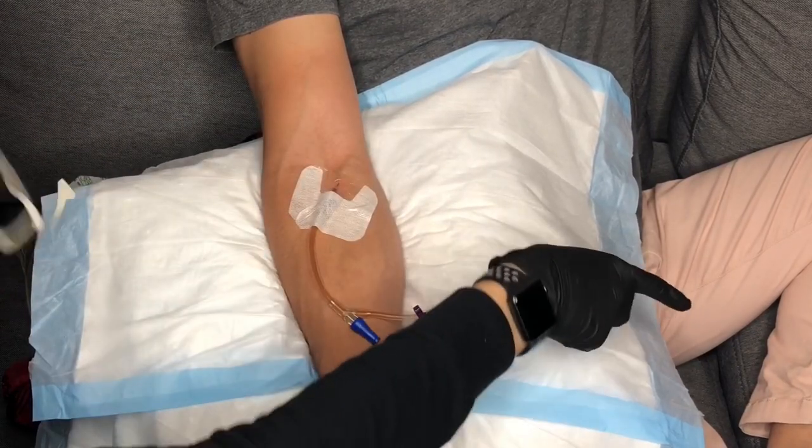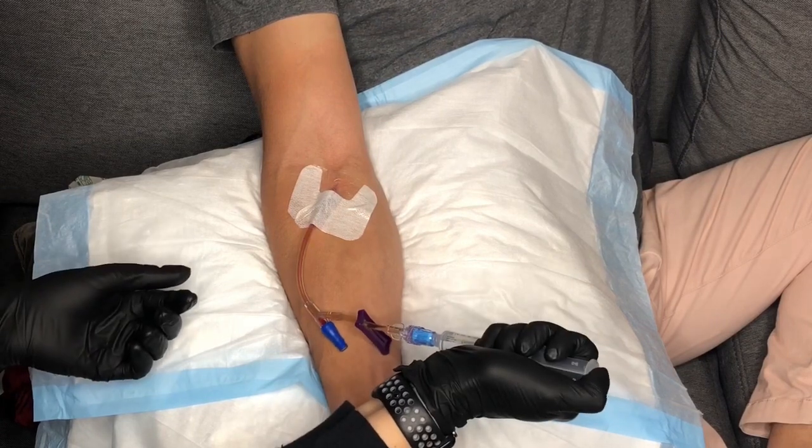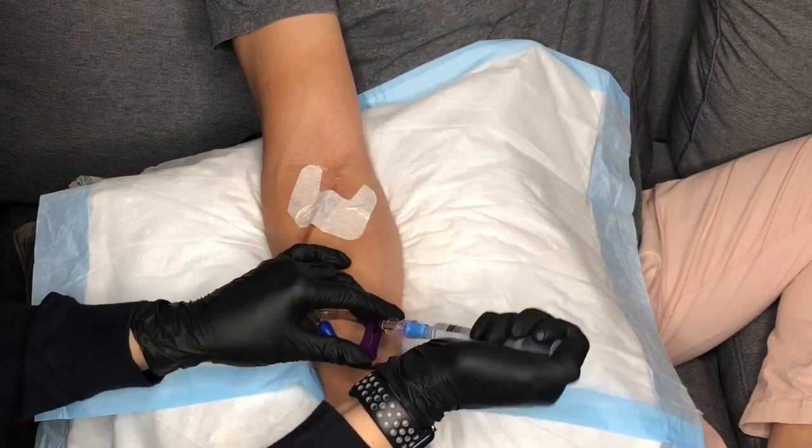And finally, after or before the Tegaderm is placed, you want to check for blood return with a saline flush before you begin administering your medication.